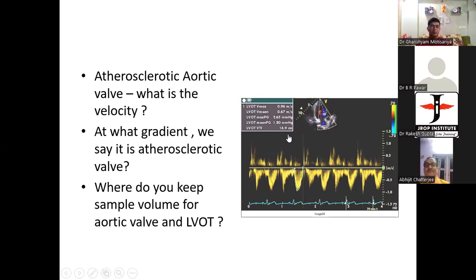Half of aortic is pulmonary, that is 0.9, and half of mitral is tricuspid, that is 0.6. Would you repeat that, please? Mitral is 1.3, aortic is 1.7, and half of aortic is 0.9, that is pulmonary, and half of mitral is 0.6, that is tricuspid. Tricuspid, yeah.